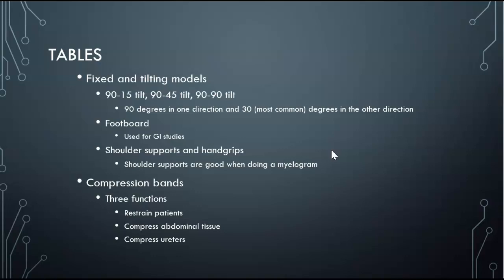It'd be terrible. So there are also compression bands that can be clipped to the tables, okay? They have three functions. One, they restrain a patient. Now, legally, this is kind of a gray area.